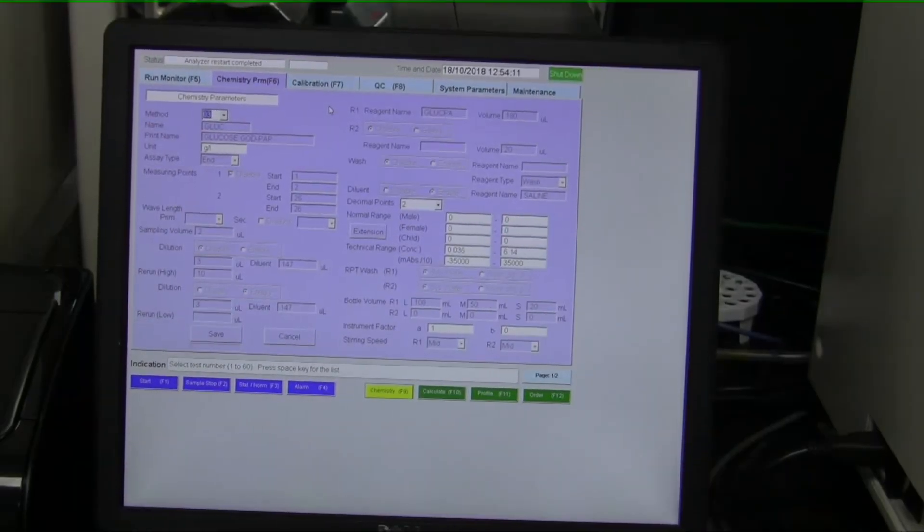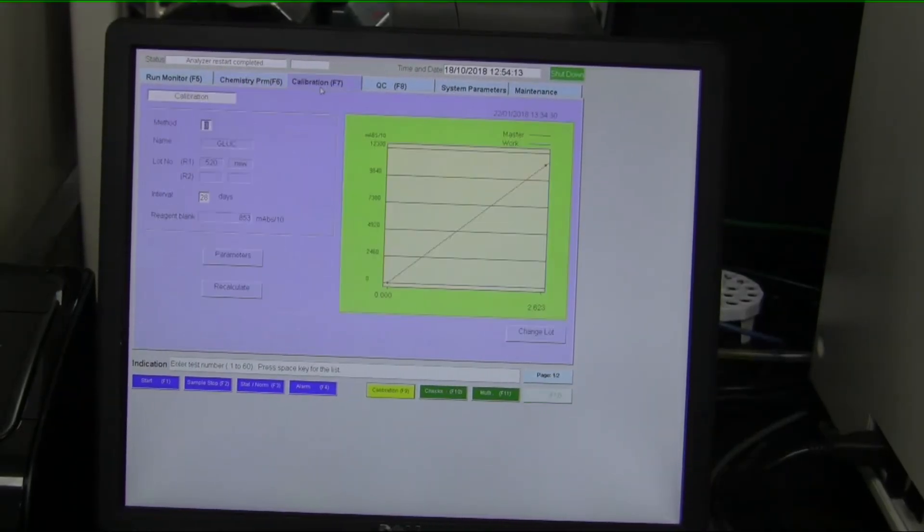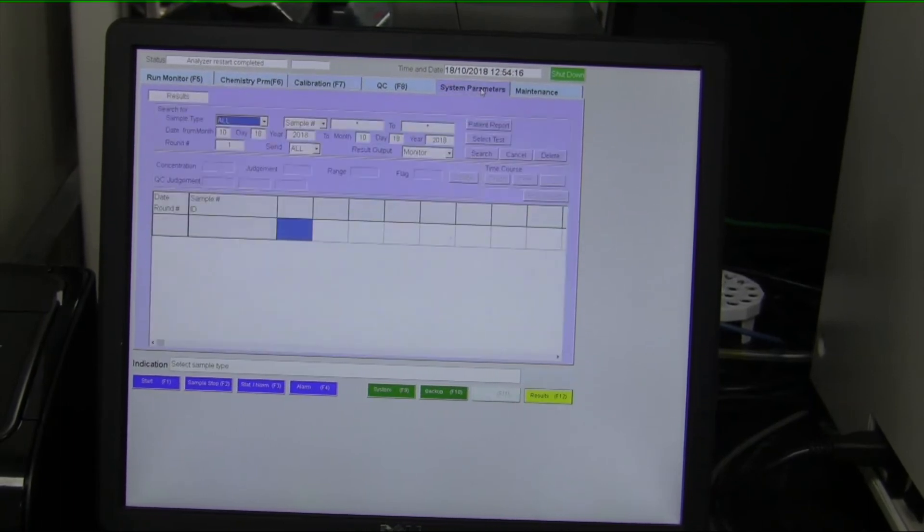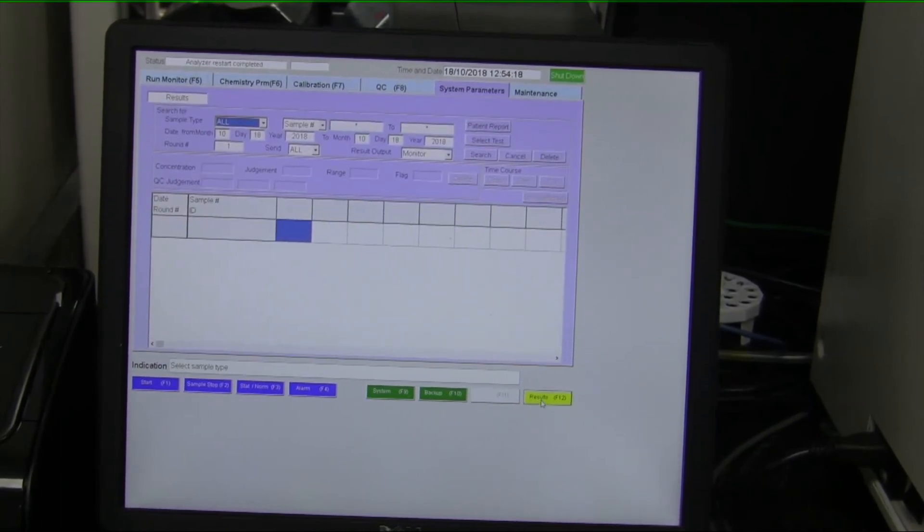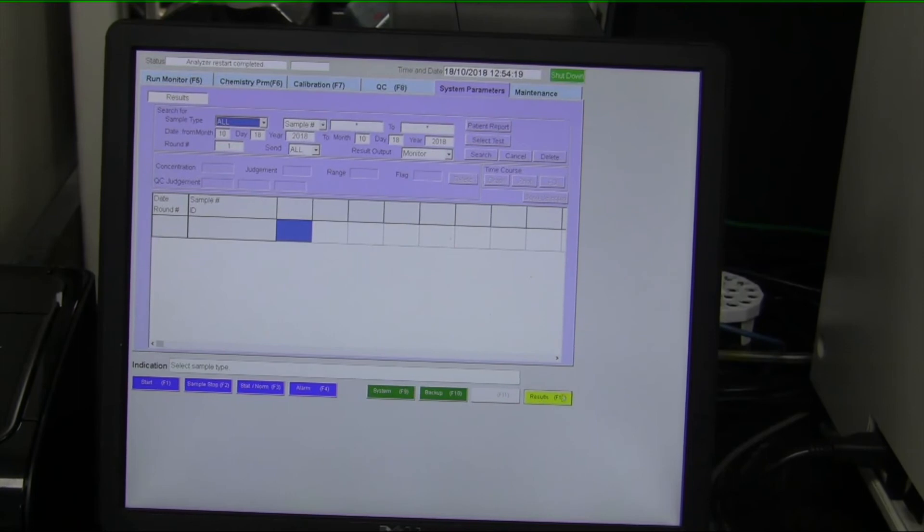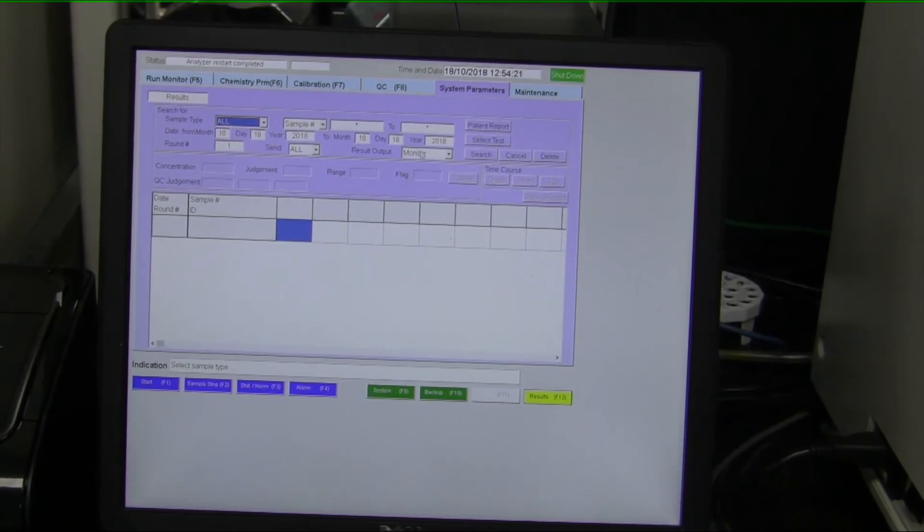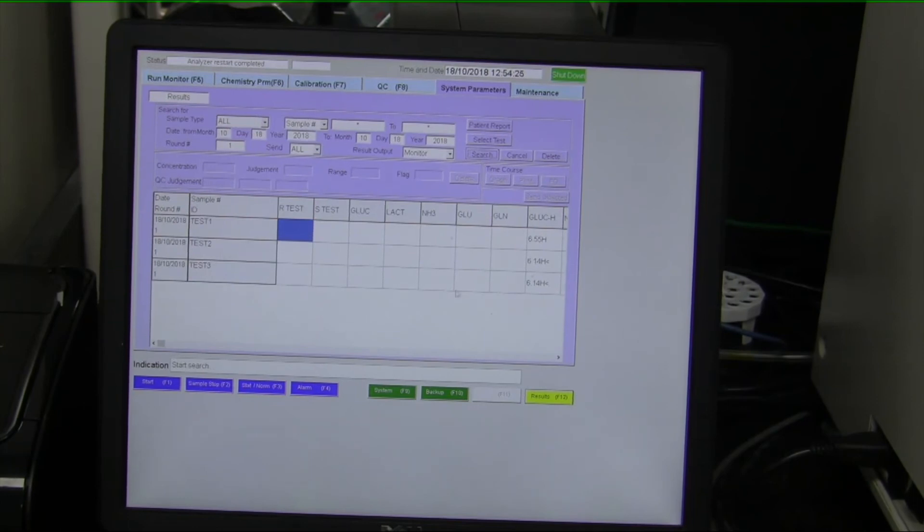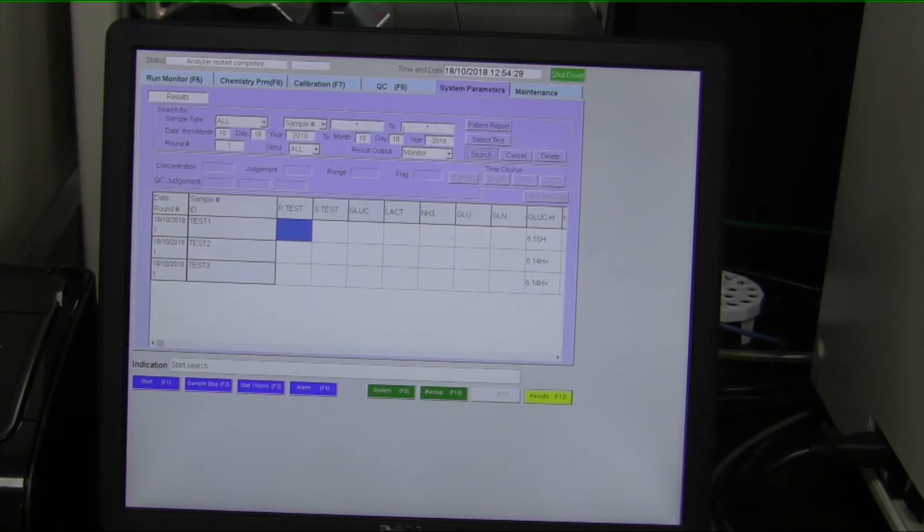Okay, so now your run is complete and you're looking to export the data. So that is under the system parameters tab. And on the bottom, you click on the results sub-tab. And if I just click search, it's going to come up with the three tests that we did on our last run. I just used the pre-populated data.